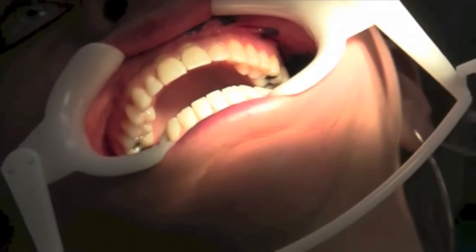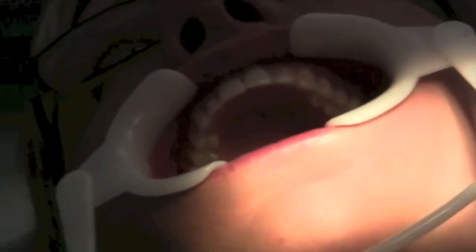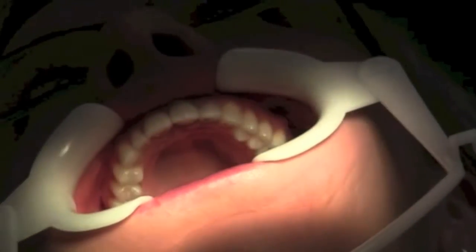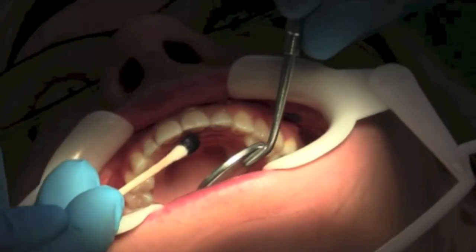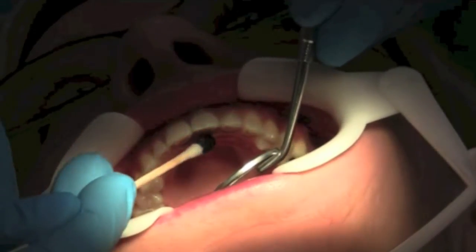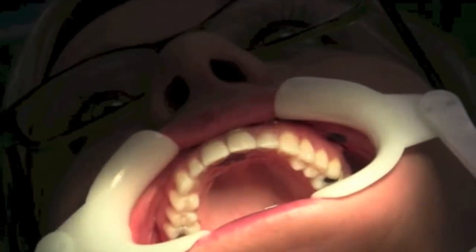So you would have your patient open. You would dry the area. And using a mirror, you would look and place topical on either side of the papilla.